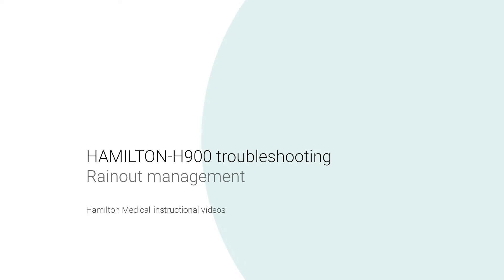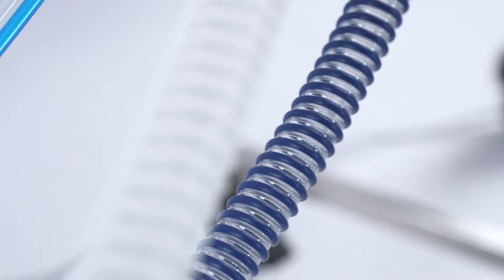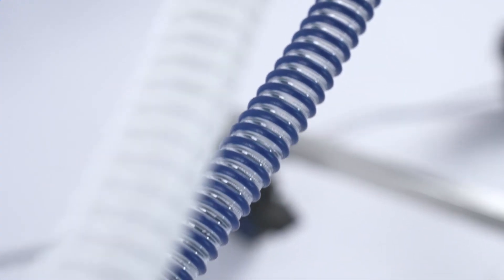Hamilton H900 Troubleshooting – Rain-Out Management. The condensation that occurs naturally with heated humidification is also known as rain-out. The amount of rain-out is influenced by various environmental and technical factors.